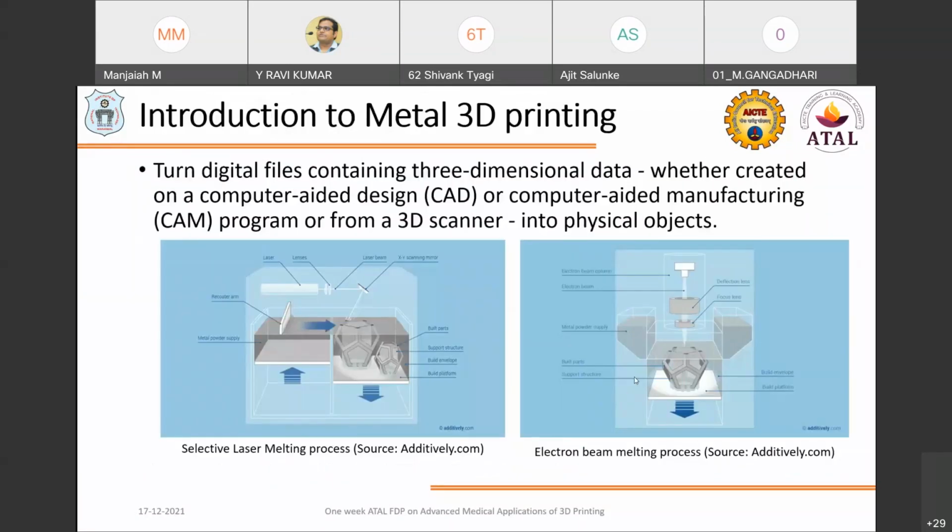With respect to metallic additive manufacturing, as we are talking about metal 3D printing techniques for biomedical applications, customized medical implants meet the specific individual needs of a patient, becoming clinical applications for a particular patient. For example, adapting 3D printing for the production of patient-specific and accurate anatomic models can be achieved for orthopedic surgeons for their operation preparations, and for guiding PG students. These kinds of applications can be made with metal 3D printing techniques for biomedical applications.